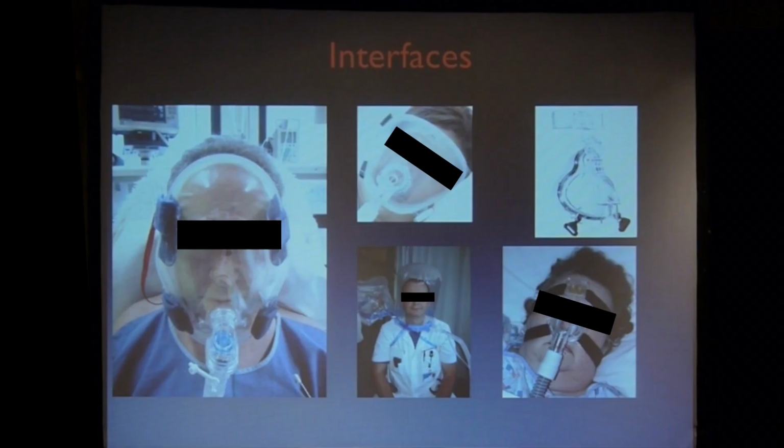Now, you have heard it from Jennifer. With non-invasive NAVA, you don't really care about the interfaces. So how we do it in the protocols right now, we change between the different interfaces, go from full face mask to total face mask, sometimes to nose mask, and you can even use the helmet. It prevents that you have the pressure ulcer. I think it's very important. Patient can choose which interface he's most comfortable with. I think that's an important advancement.